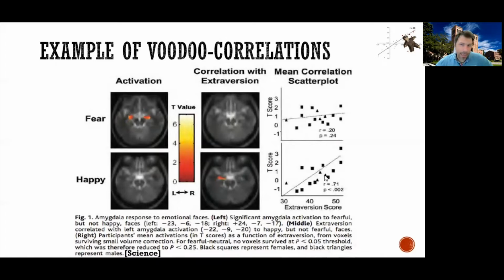For example, in this experiment, we can only look at the central result and the one on the right. The panel at the bottom in the middle is showing which voxels correlate at a full brain analysis with extraversion. And then if you take these voxels and you turn them into an ROI and you put them here, you notice that they correlate a lot with extraversion.